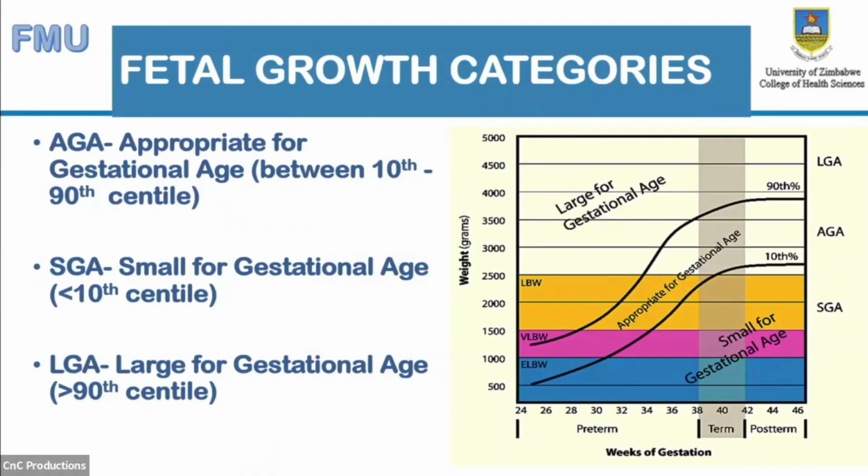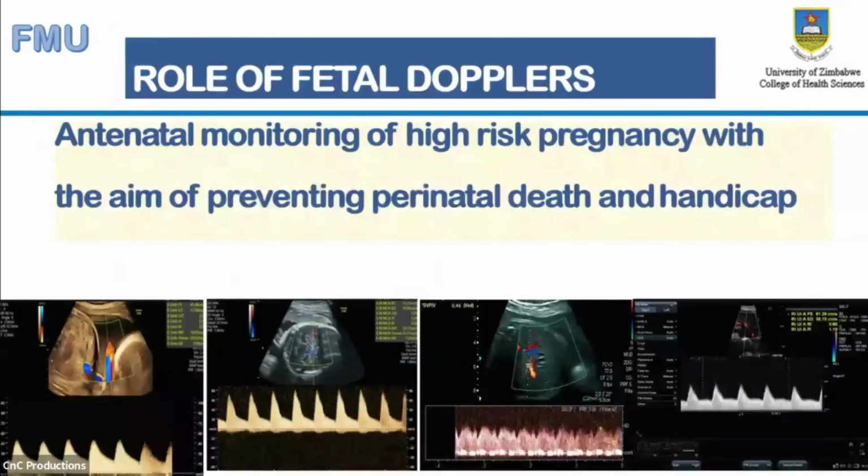So this is what was happening when the dates were being forwarded or reversed when people were still in ignorance. So now you know that what will be causing the date to be moving forward is probably the fetus growing small for gestational age. What was causing the gestational age to be coming nearer was because it was going for large for gestational age.